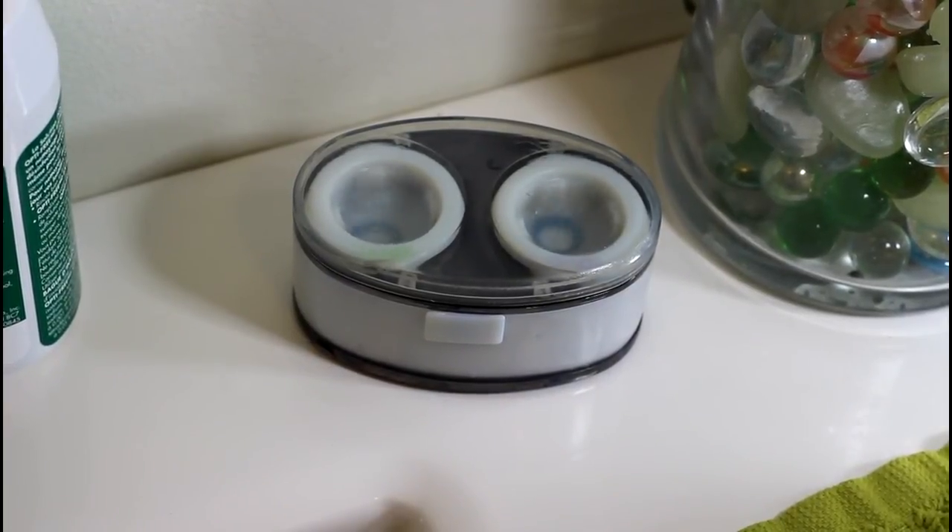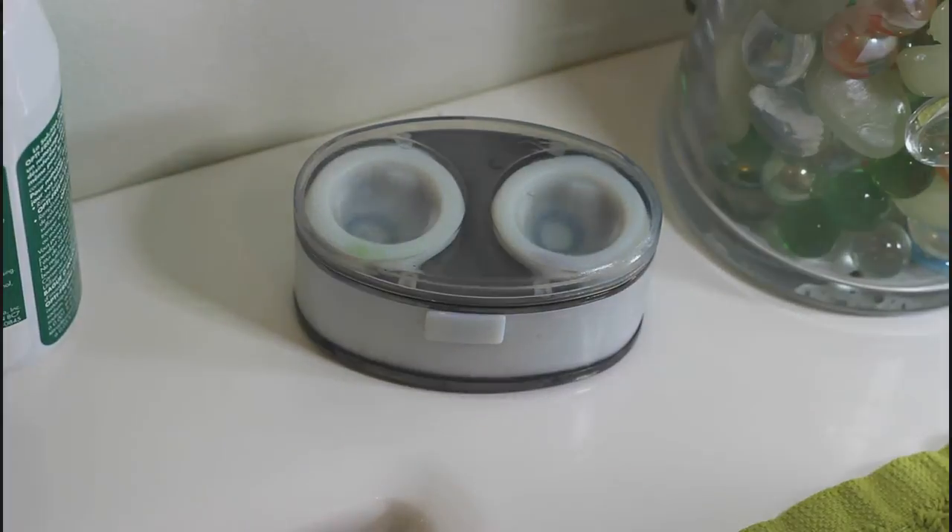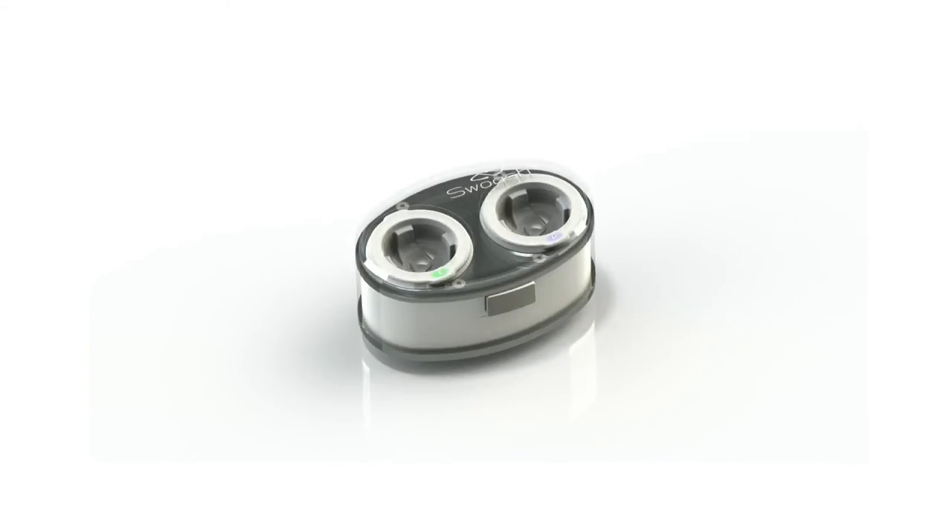Reduce the chance of infections and make your contact lenses more comfortable to wear. Get the Swoosh case.